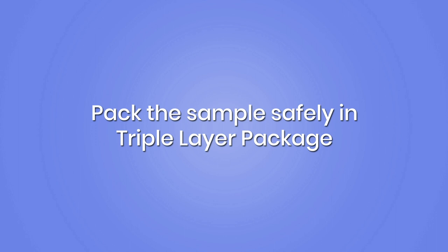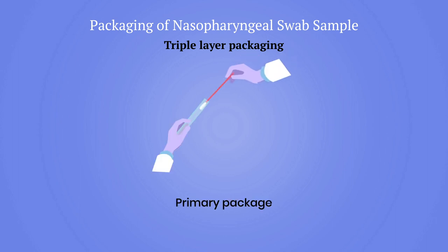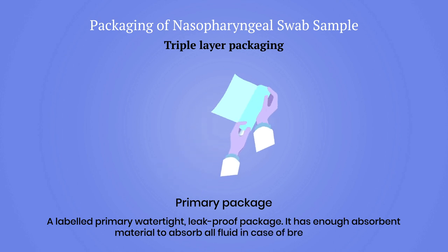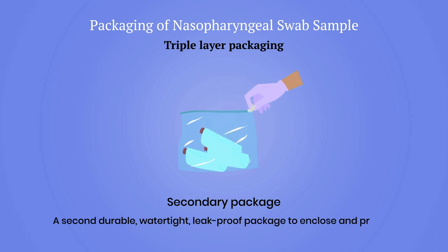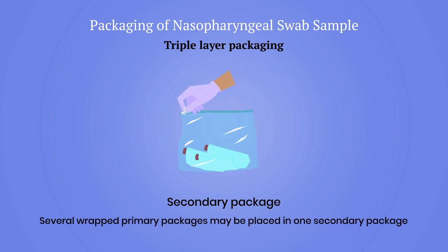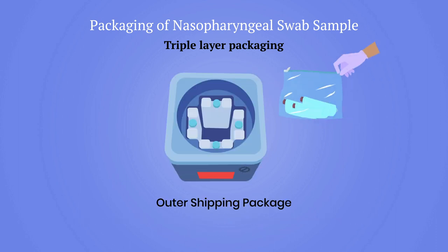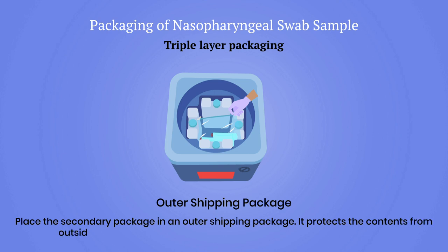Samples should be safely packed in a triple-layer package consisting of three layers. The primary package is a labelled watertight leak-proof container with the specimen, wrapped in sufficient absorbent material to absorb all fluid in case of breakage. The secondary package is a second durable watertight leak-proof enclosure protecting the primary package; several primary packages may be placed in one secondary package with sufficient absorbent cushioning. The outer shipping package protects the secondary package from physical damage and water during transit.